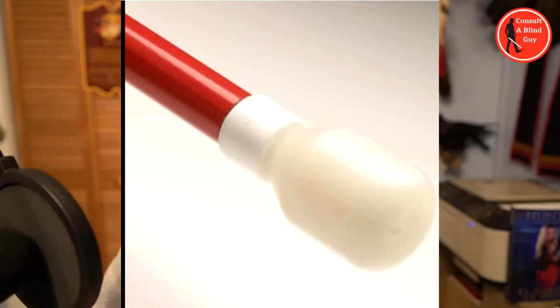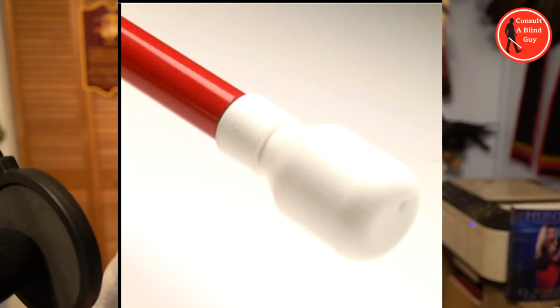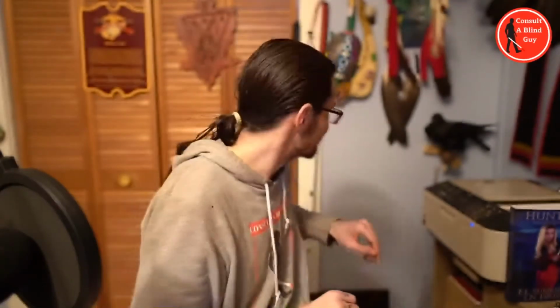And then, not specifically on hand, is the high mileage, which is still sort of a marshmallow style. The description says popular Ambutech high mileage cane tip is a marshmallow style cane tip molded from a high abrasion resistant engineered polymer that lasts 2 to 3 times longer than the nylon hook style cane tip, attaches to the elastic cord and mobility canes, and is $2.40 USD. And then you have the standard marshmallow tip, which is also $2.40. It is a hook style tip, attaches to the elastic cord and mobility canes. And then a good example, just to show you briefly real quick.